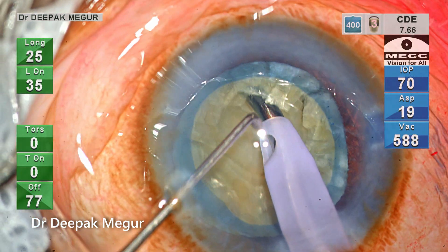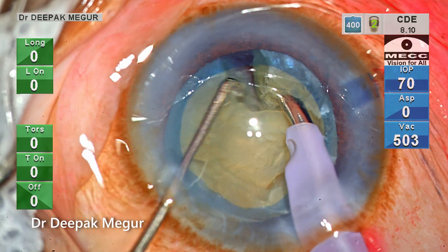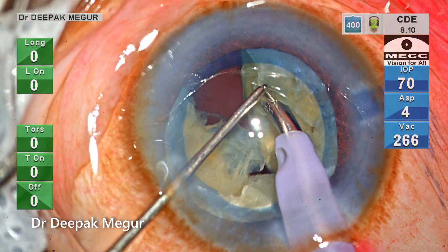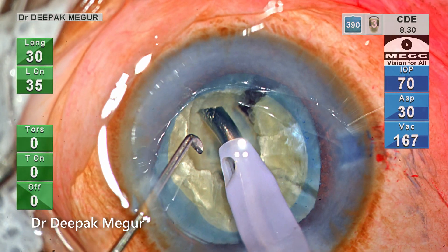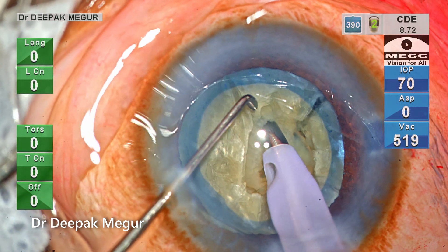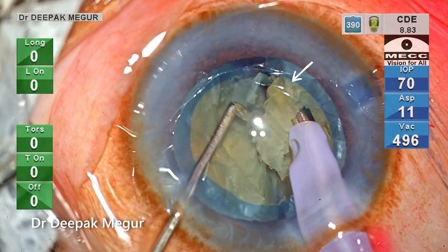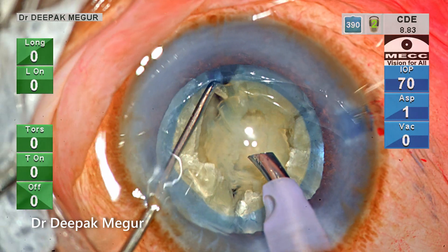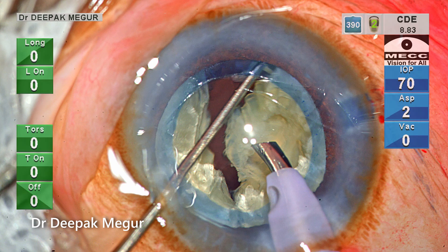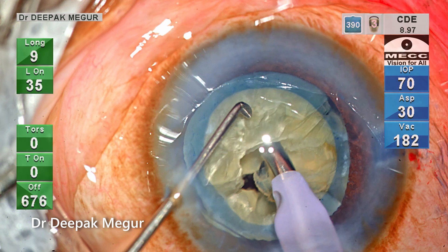I'm doing a vertical chop in eyes where there is no epinucleus cushion and the nucleus is very hard. The trick to ensure I don't put stress on the zonules or the bag is to lift the nucleus up so it touches the anterior capsule, then move the chopper down vertically and then laterally. With this maneuver, if you're careful, no stress is put on the capsular bag.